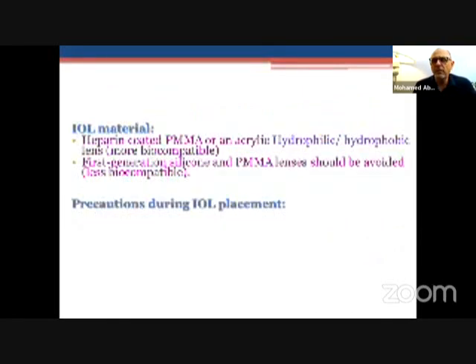The lens material we used to use was heparin coated, but it's not available anymore. However, hydrophilic and hydrophobic intraocular lenses are very well tolerated by uveitic patients. However, the first generation silicone lenses, mostly not available now, and PMMA lenses still present, are not very well tolerated.